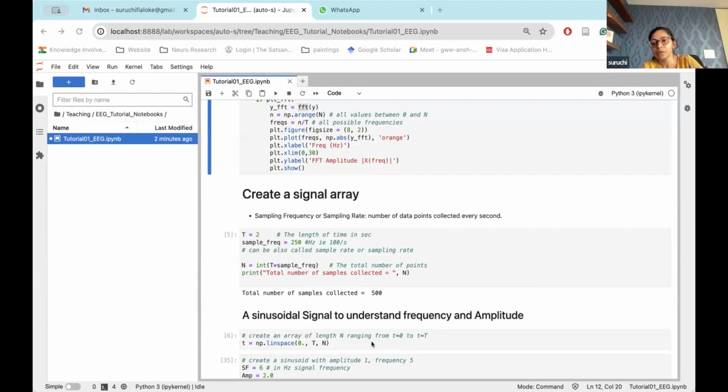I think that is the most common we get, called European data format. With Brain Vision, it will be something else. Brain Vision is not EDF. Brain Vision has its own format. So we use a library which is for that particular data format. Or we can convert that. I think it would be very difficult to convert each of them. It will just change the first line of the code, how you load. Which function are you using to load the data? We'll change that.